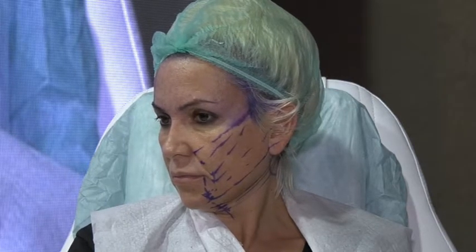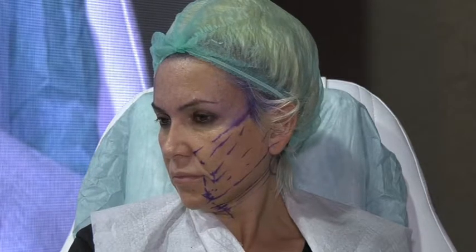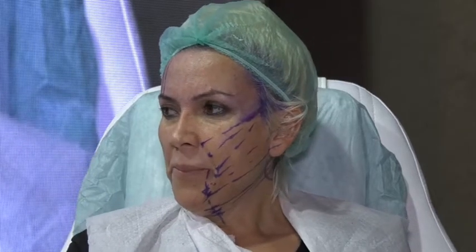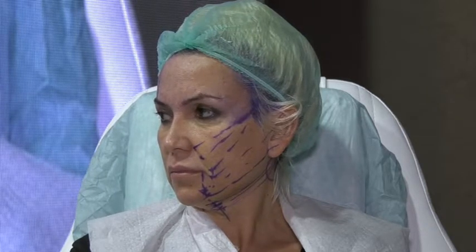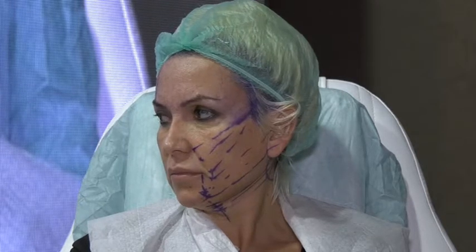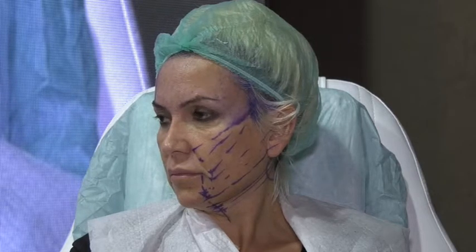I think I put this video many times, where the whole case lasts 10 minutes from the patient entering the room till he left. It was all 10 minutes, including marking, disinfection, anesthesia, application of the thread, cutting the thread, cleaning, giving instructions, all of that. So the procedure itself takes 3 minutes.